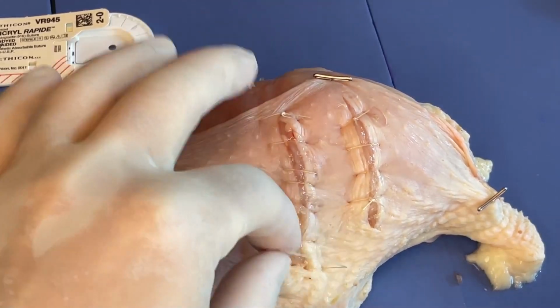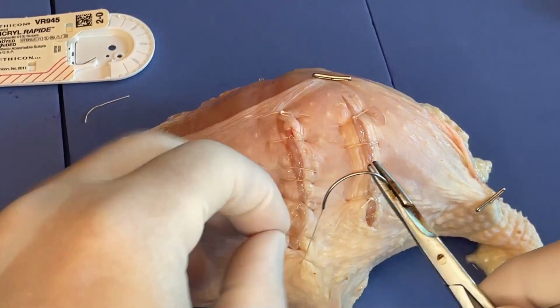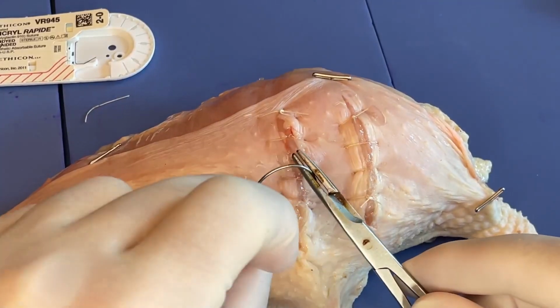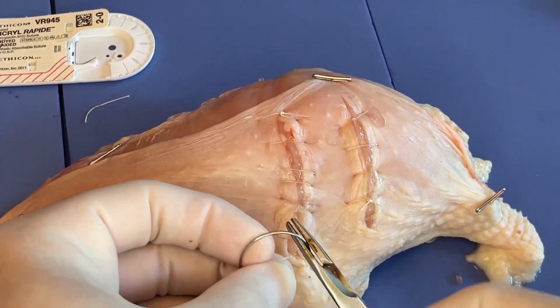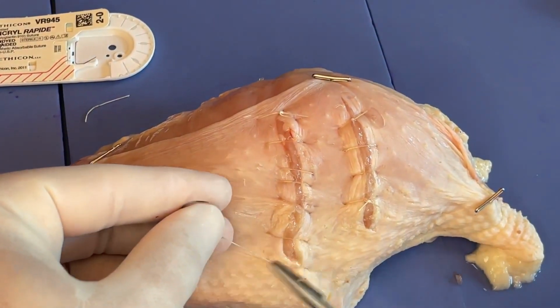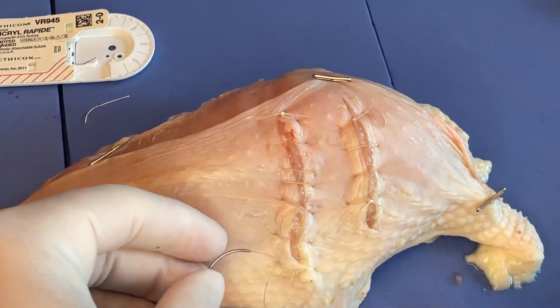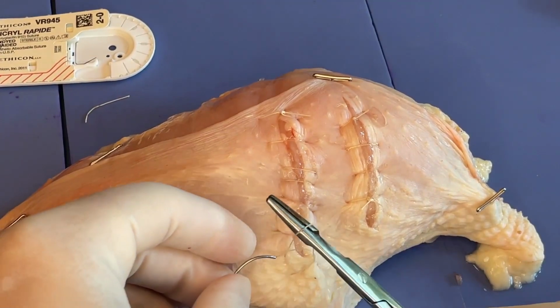So I'm just going to do one more right beyond, just a little through and through like that. And then when I go to tie this, all of that tissue will be contained kind of within our suture, so to speak. And since we're short here, again, I'll do a little instrument tie.